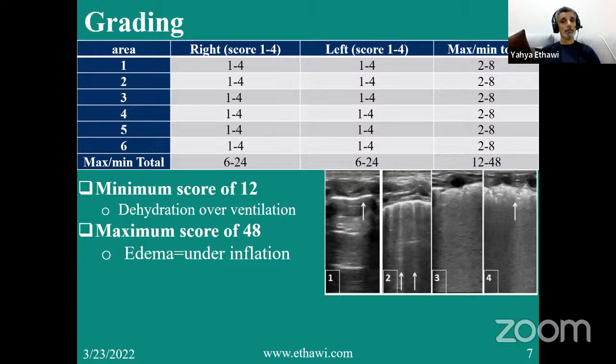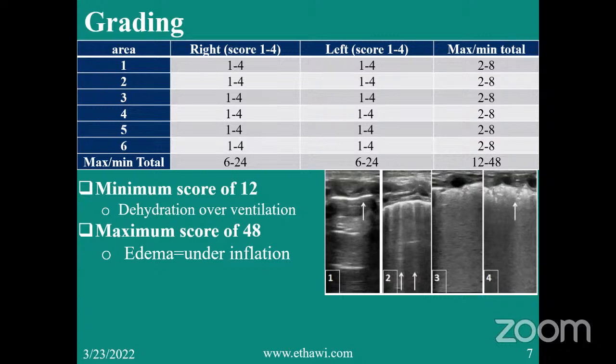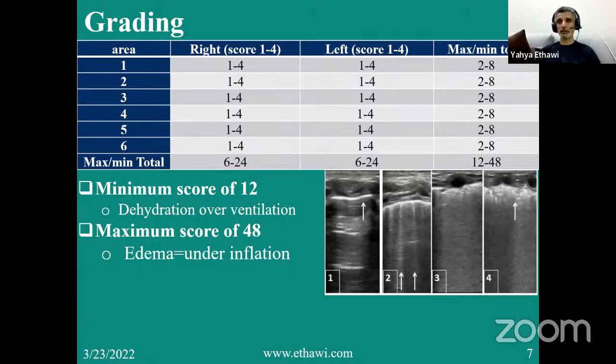Okay. More questions? Yes, Dr. Yaya, but sometimes a baby comes with respiratory distress. We suspect TTN and maybe meconium aspiration. We found a normal X-ray. It's possible that the X-ray is totally normal, even though there are some symptoms. In 70% of situations, the X-ray is normal and the finding on ultrasound is there. I will show you cases.